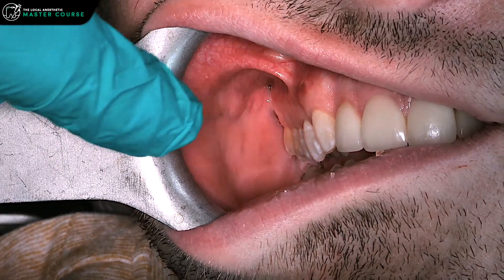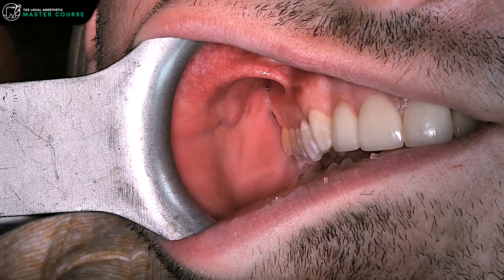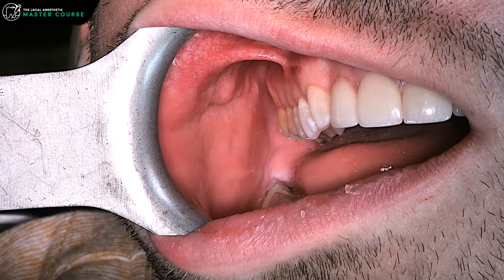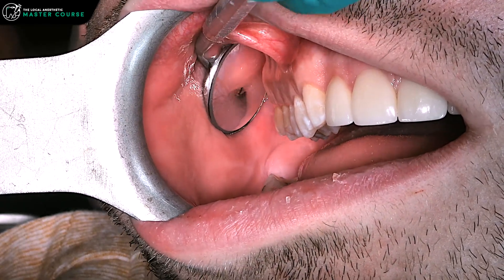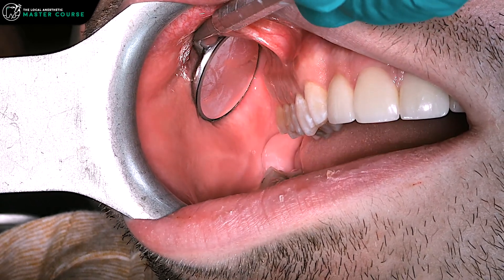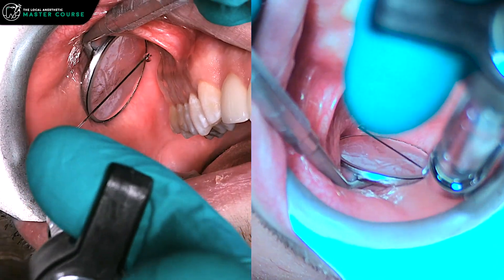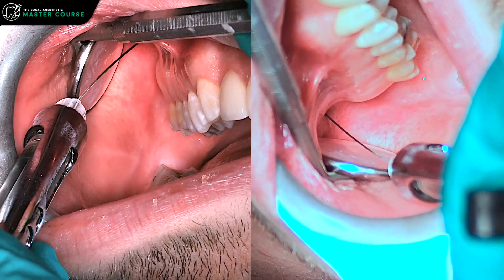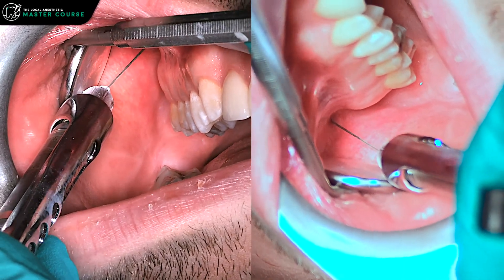Have the patient shift over toward you at the lower jaw — you can see things opening up nicely. Retract the cheeks for good visibility, then insert at the height of the vestibule posteriorly, going 45/45/45. There may be times where you contact bone a little too soon.